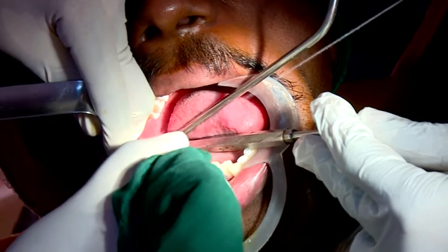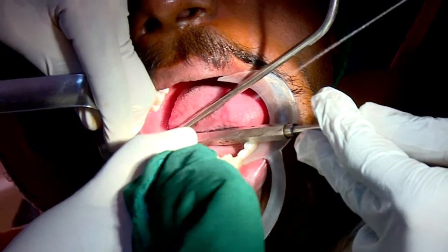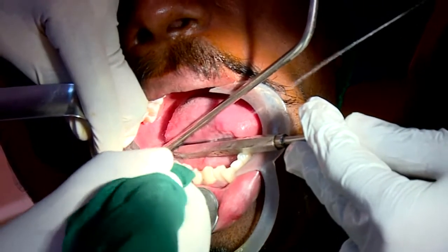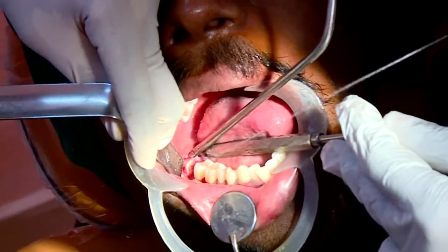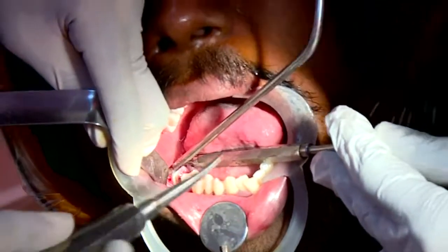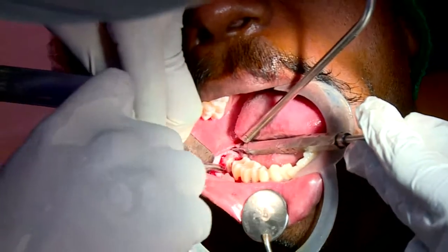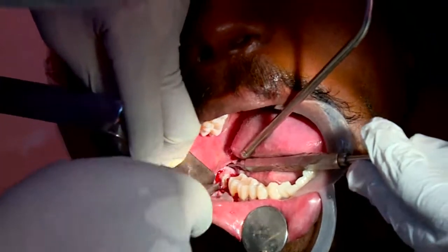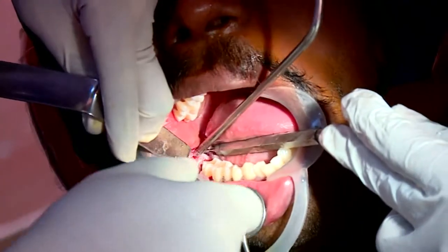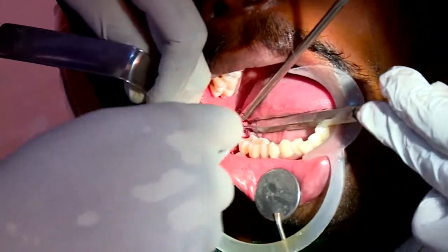Are you going to split the root, sir? Yes, I am going to put the elevator and see. If it is resisting, I am going to split the root. So, sir, now activating this gutter, making this gutter a little more, putting a point of application. You can put a small point on the remaining root structure and try to push it into the space that is available. You can see it move.